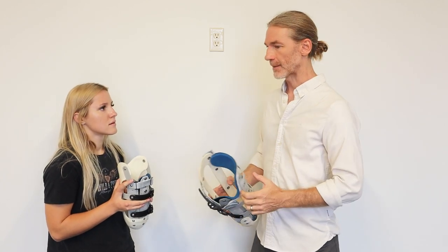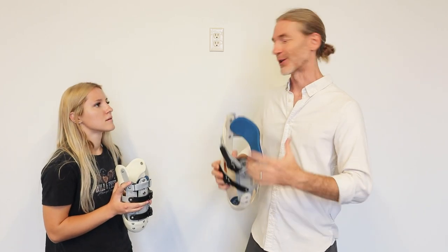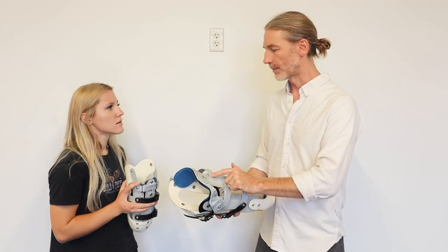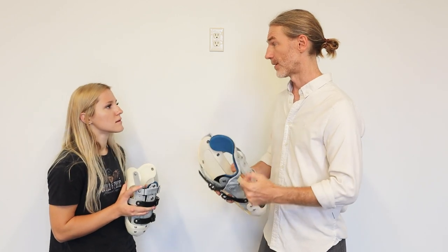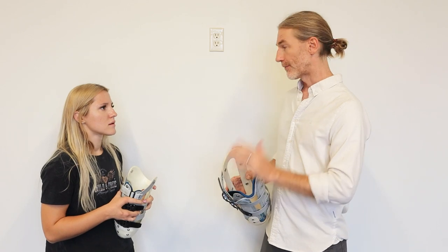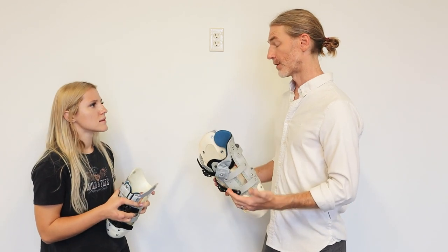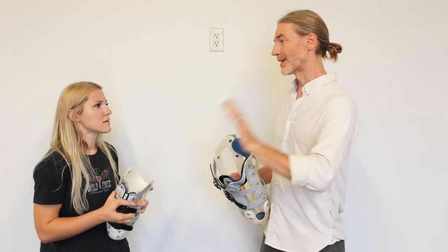Instead of the tool set being plaster and hard plastic and heat guns and grinders to sculpt a hard piece of plastic to match the human body, we're literally adjusting little screws — very similar to an erector set or Lego set. You just plug and play pieces. Our goal is to make comfort accessible to all amputees. To do that requires a faster fitting process, so you have more bandwidth to see more patients and serve more amputees.